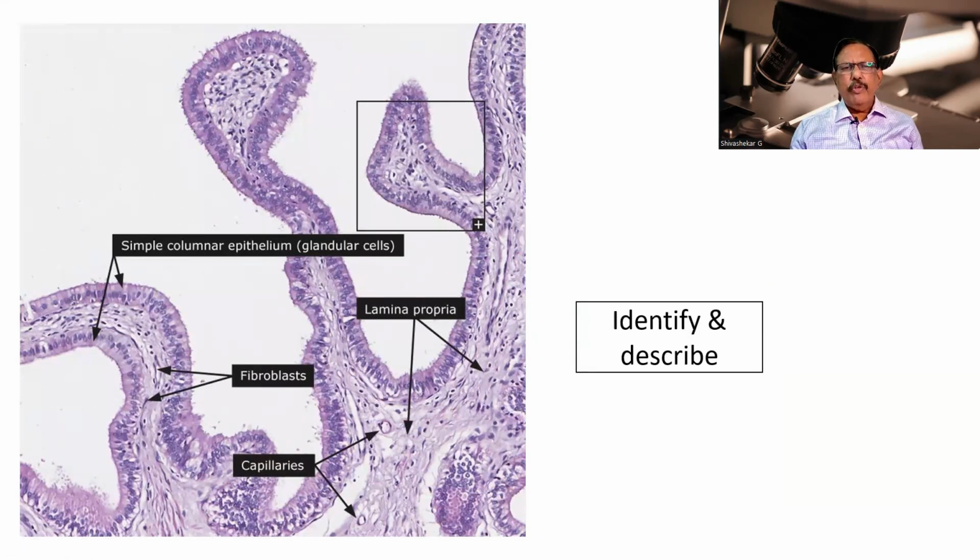For example, the mucosa is thrown into folds. It is lined by columnar cells, and the nuclei are somewhat basal. I am able to see the microvilli at the tip. They are all supported by the lamina propria. Such a flow will come to you once you people start talking. In fact, you must develop a verbal diarrhea.